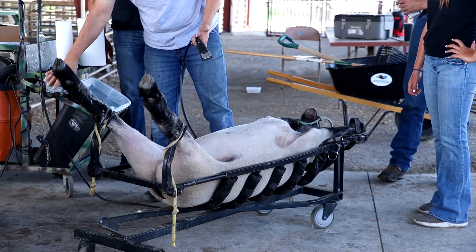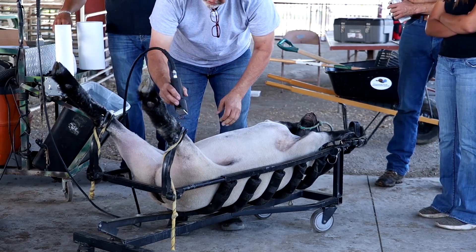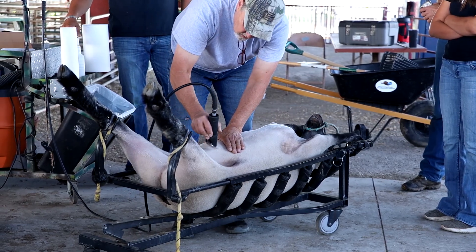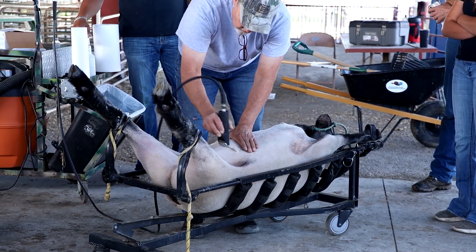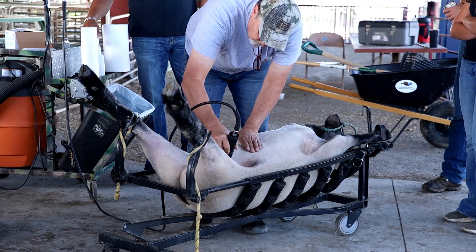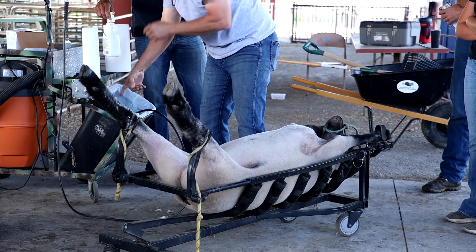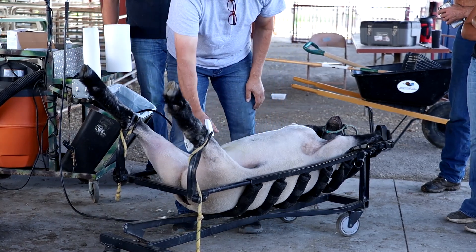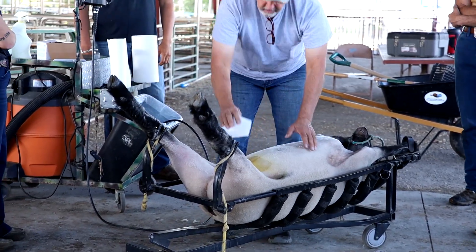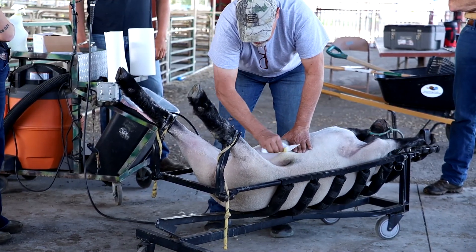Turn the clippers on this way; hold them like a pencil, straight up — you don't have to press on the skin very hard at all. Pull this tight and go backwards, take all that fuzz off. Drop those in the garbage. Then spray with betadine — alcohol first — and take a couple paper towels and scrub it, pulling the skin tight, scrubbing until it's clean.